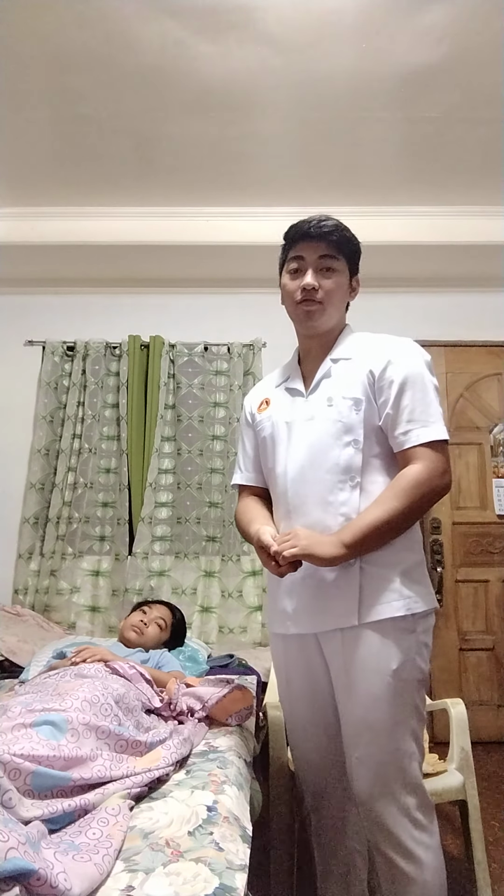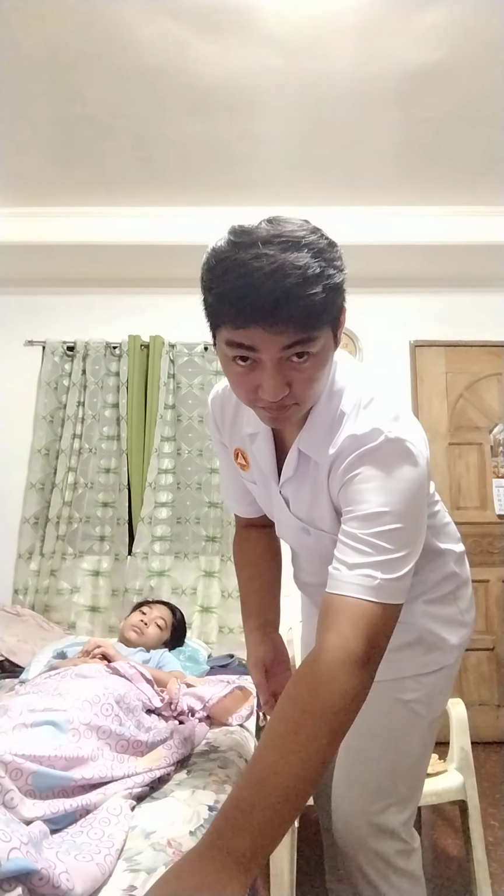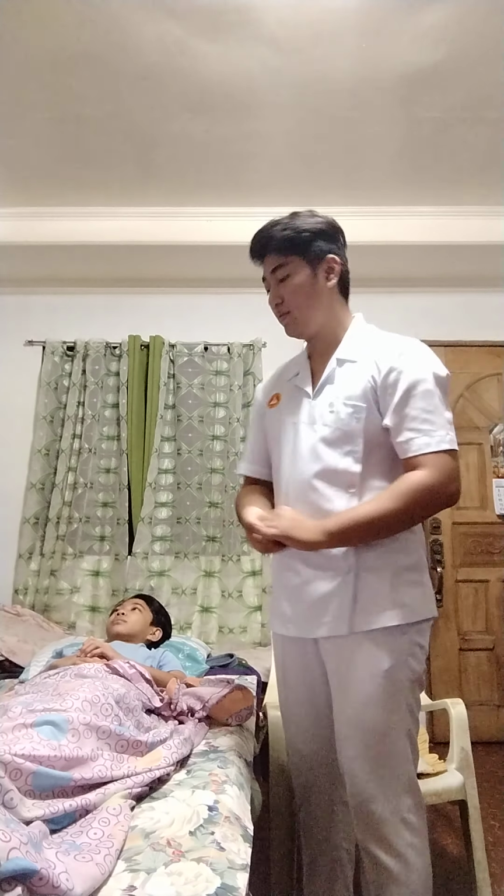Encourage the patient to make use of the stand assist device and assist the patient to sit up on the side of the bed, and ask the patient to swing his or her legs over the side of the bed, and at the same time pivot your back leg to lift the patient's trunk and shoulders, and keep your back straight and avoid twisting.